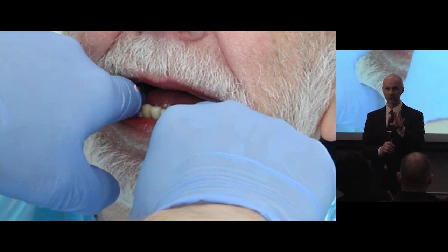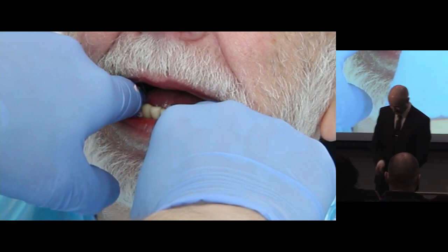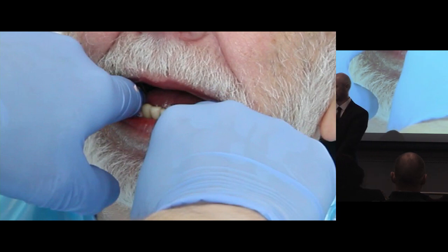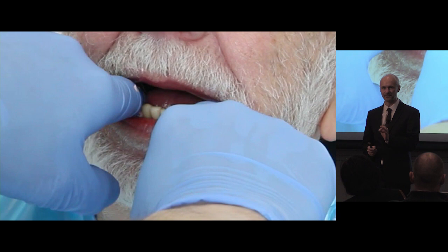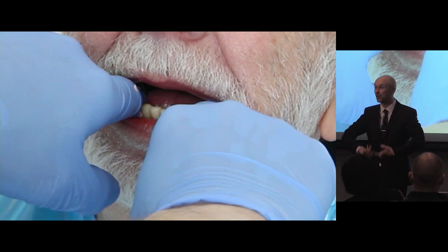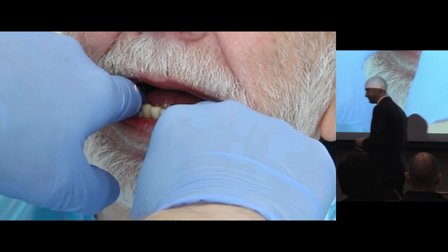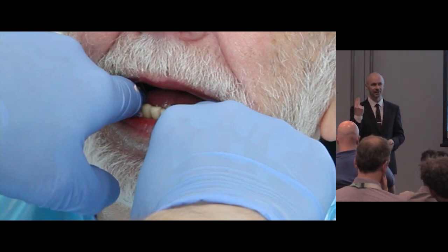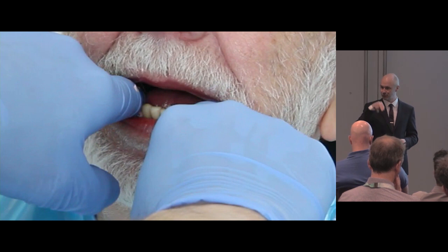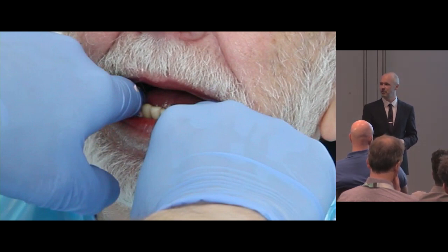Now, with zinc oxide, it usually takes 2 goes. So I'll do those first 5 things, and then do the second 5 things. But I think the really, really important bit is the swallow. I want that floor of the mouth to come up and really mould that lingual surface of the zinc oxide. And did you notice Claire had a 3-in-1 tip and she squirted it in the mouth just before he did the swallow, so a little bit of water just to help Bert to swallow.